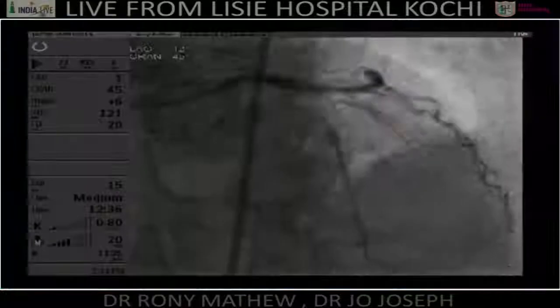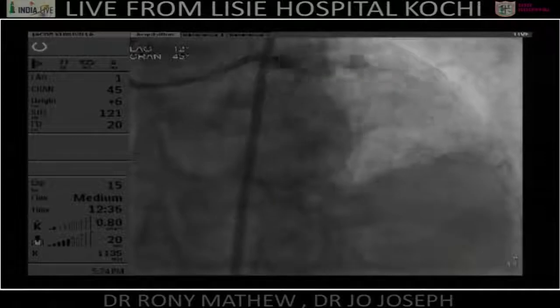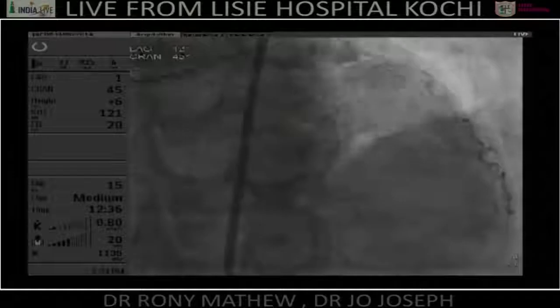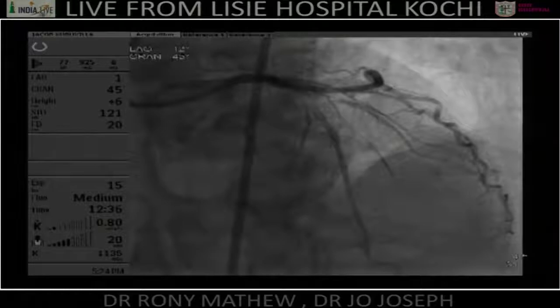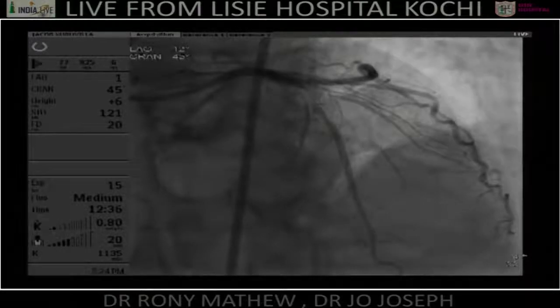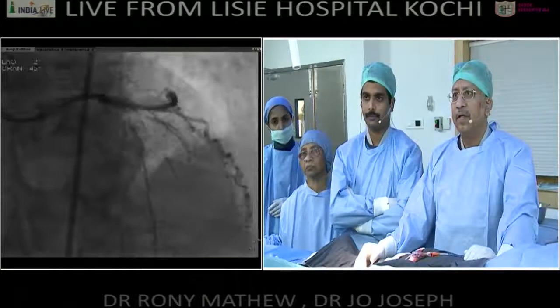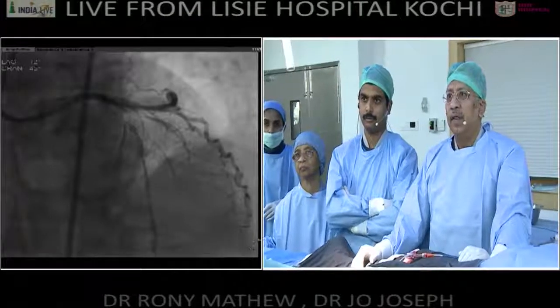Right, now let's go to the angio. I hope you're seeing the angio right now. Are you? Yeah, we're just seeing the angio. We're seeing the couple of views you've shown us. Right. So that's a tight LAD D1 bifurcation, Medina 1,1,1 true bifurcation lesion. Can you go back and freeze that point? Zoom that so that they can see the bifurcation. Now go to the next shot.